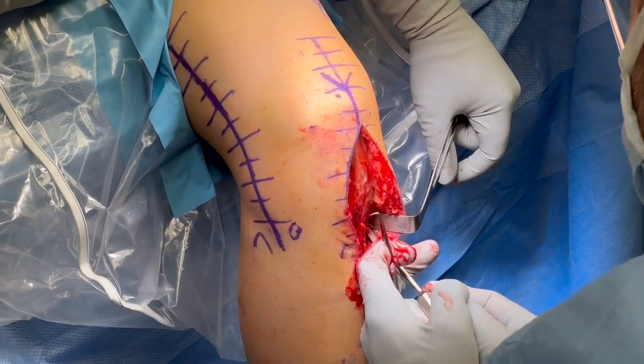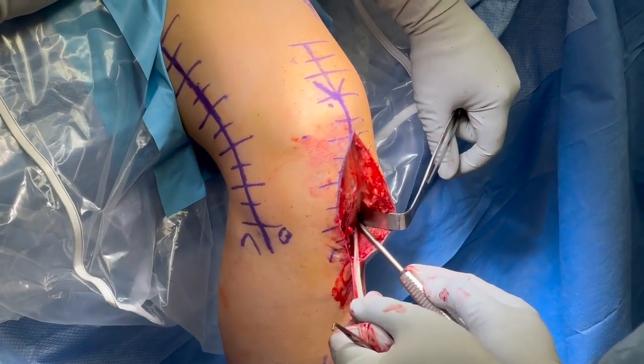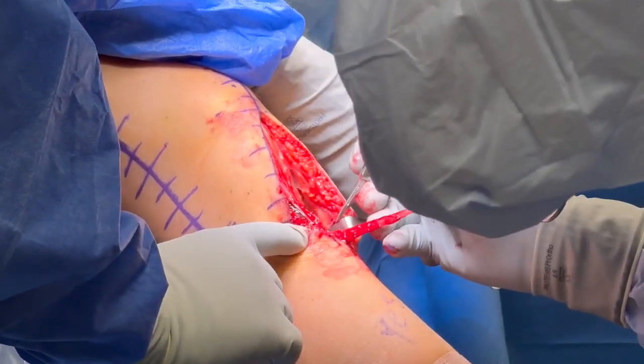Using an open hamstring harvester, the semitendinosus autograft is harvested proximally and then dissected off the tibia distally.